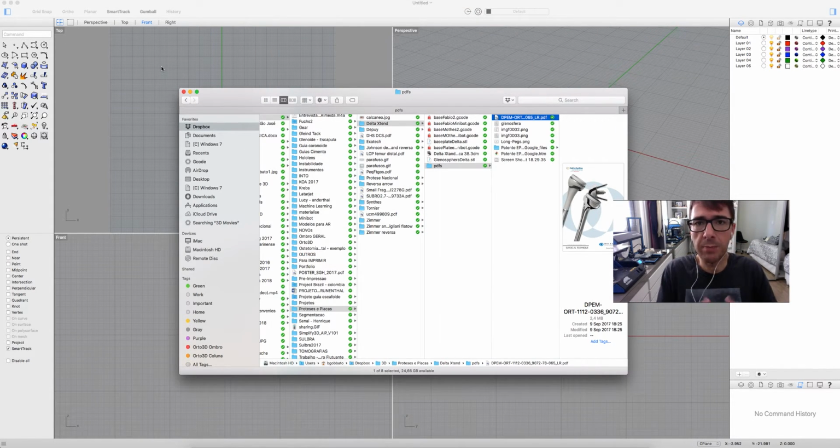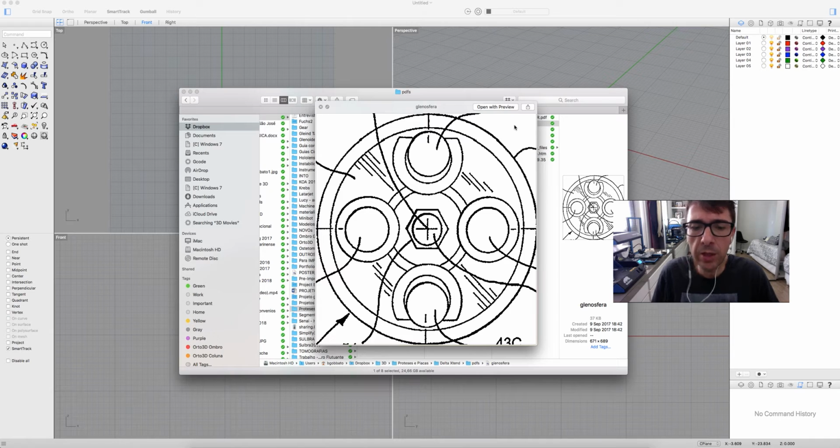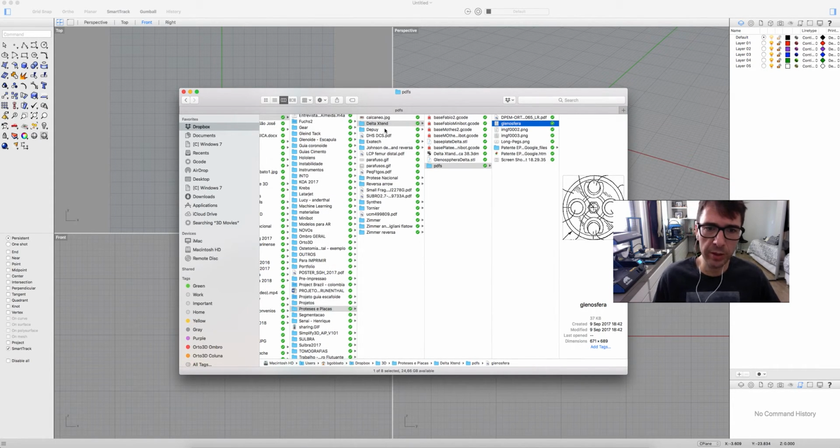We can do this by hand, but I suggest taking pictures of the implant. So here I took a picture of this implant. This is from the actual patent. It's available online, but you can have your own pictures, okay? It's no problem. I think I have here some pictures.